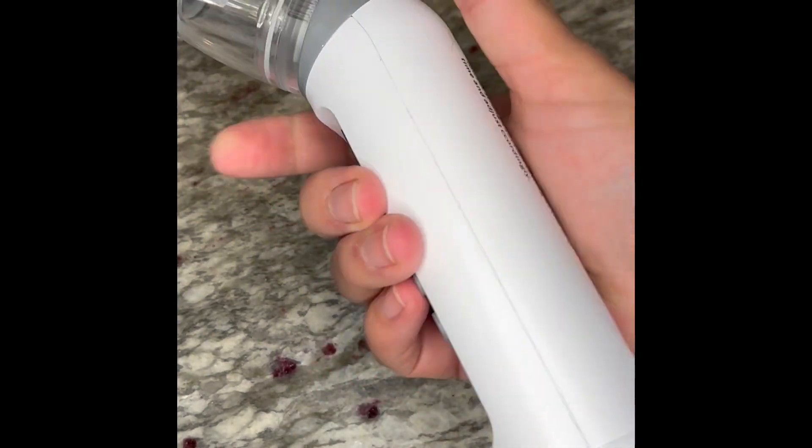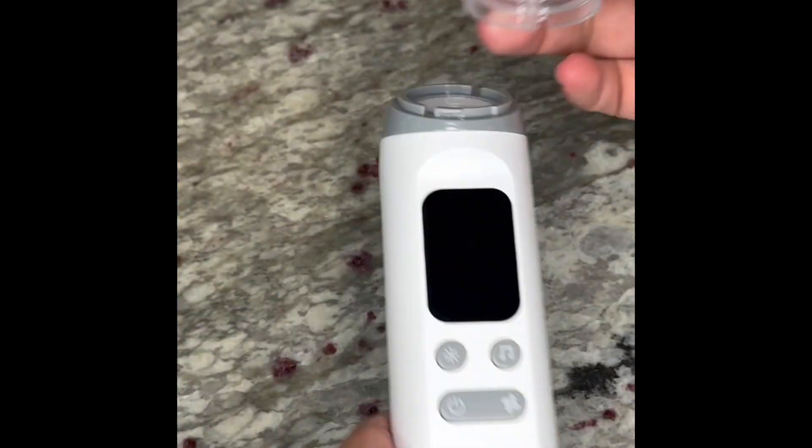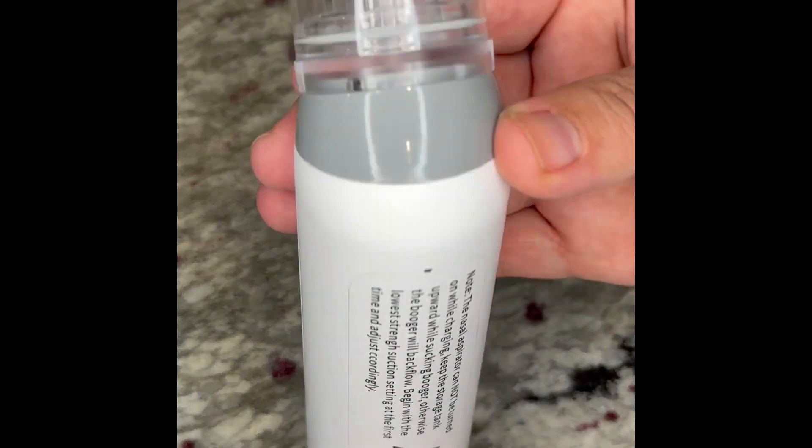The nasal aspirator for baby has been a game changer in my parenthood. I love that it's easy to assemble and it is easy to charge by using the rechargeable cable.